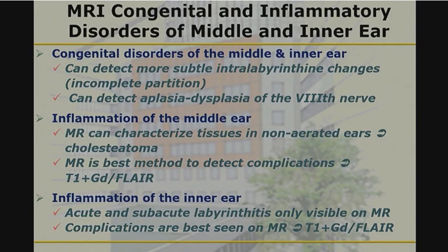We do a double injection. We do double dose in IV. And since we do that, we do 15 a week, and clinicians, they are fond of it. So please don't inject intratympanically. It's not needed. It's not needed anymore.